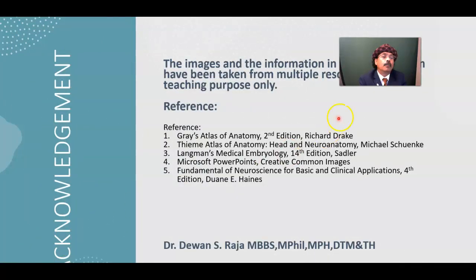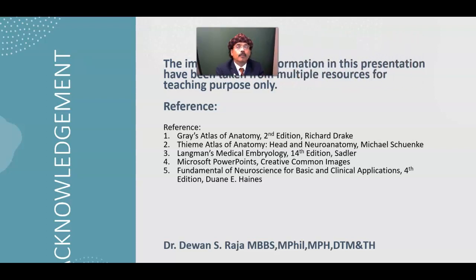And that's all about the retina and ophthalmoscopy in a normal person.